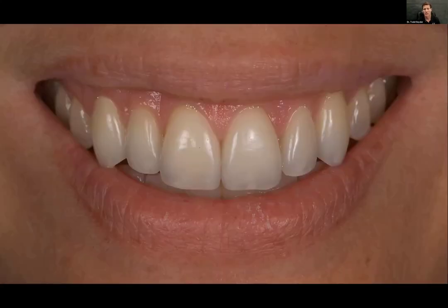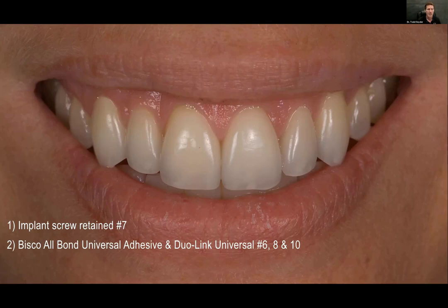All right. So here's obviously the final. I want you to see this, and I'm going to tell you how we put it in. We have all these different veneers, implants, and crowns, and we've got them all to look the same, even though we're using different types of materials. We have a screw-retained implant, which really doesn't apply to what we're talking about here. But then we have the Allbond Universal on 6, 8, and 10.